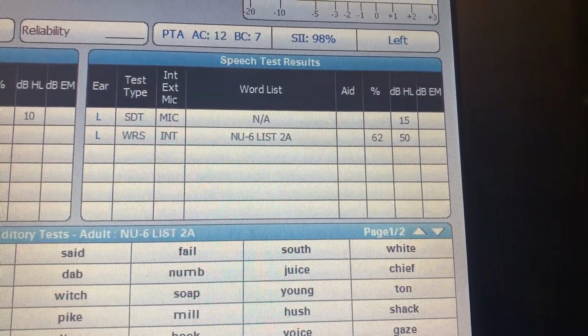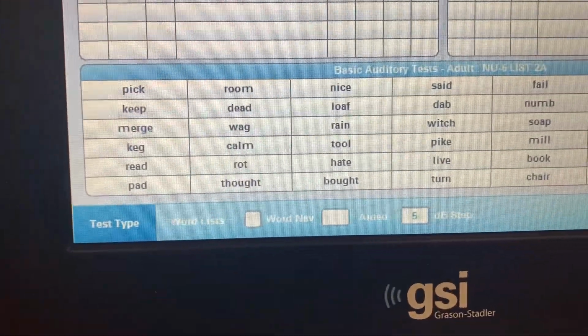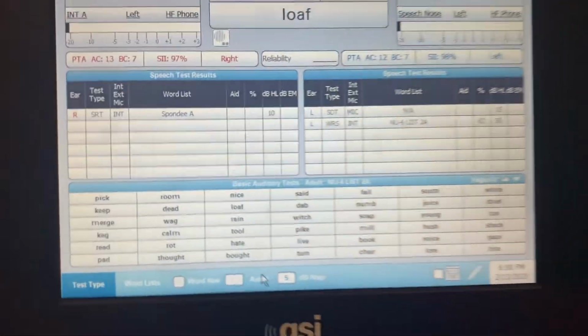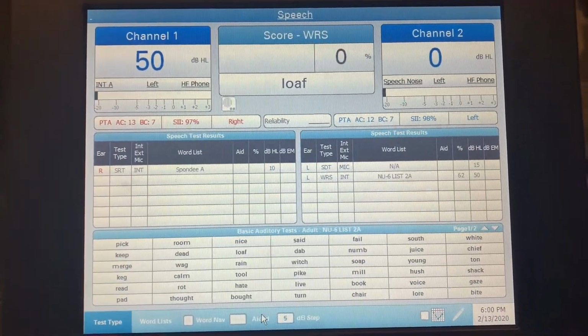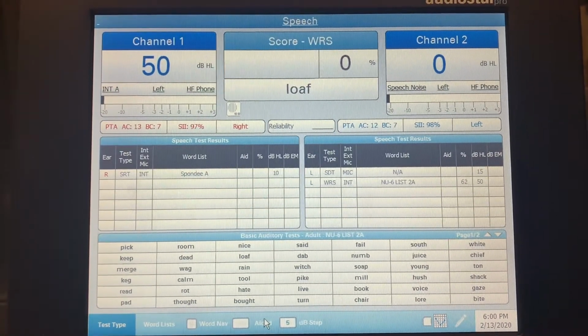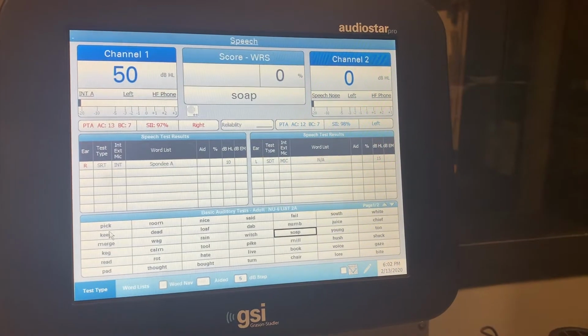And you can do this through the speaker and add in your aided, whether it's a hearing aid or a CI. So you have multiple uses for this, but you want to make sure that you're keeping track of the score on the screen.